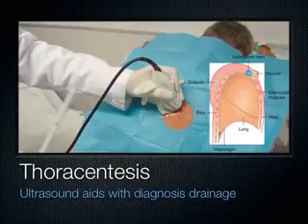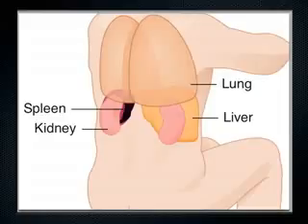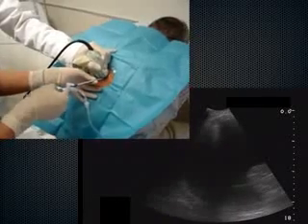So unless you really want to get a spleen or a liver biopsy, it's probably a good idea, if you have the ultrasound, to use it while you're doing the procedure to guide. You can actually see the needle going into the fluid, and know when to stop pushing. Just gives you an idea. See my needle, from the fluid and air around. All right, we've got your needle here.